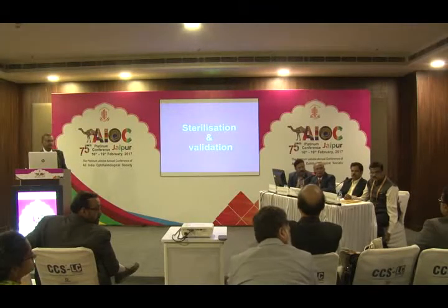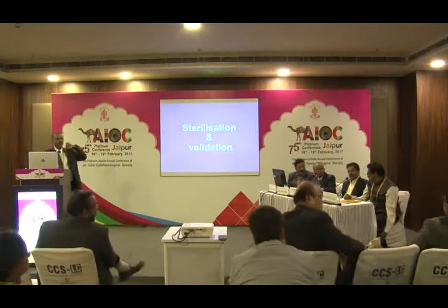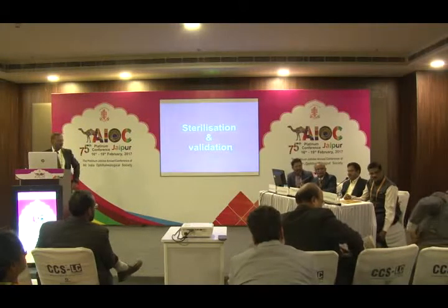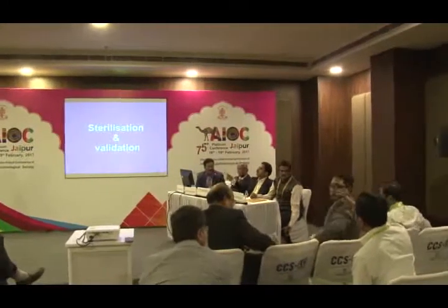For drying the equipment? Keep it overnight, or use a hair dryer. Use a hot air dryer, or there are instrument dryers.